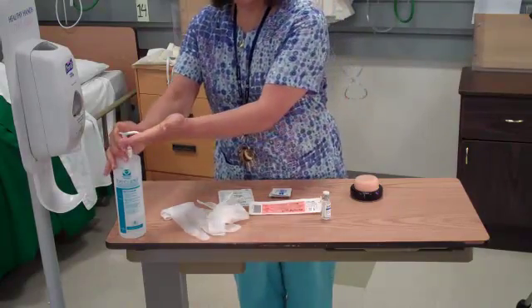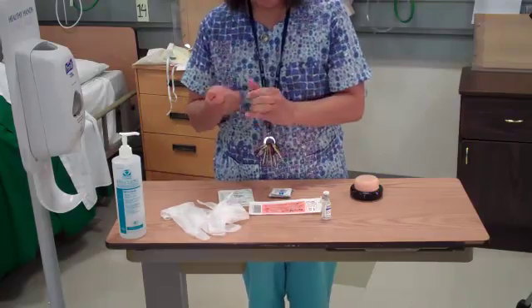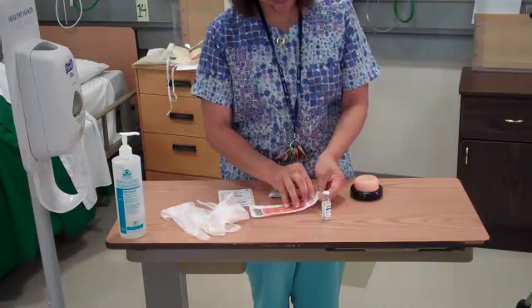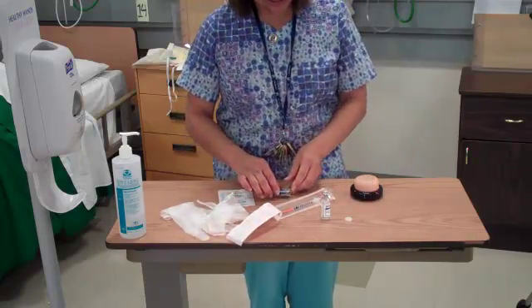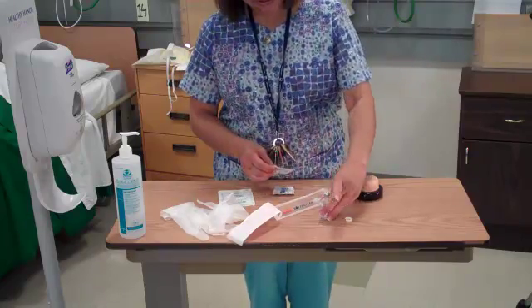I'm going to go ahead and wash my hands and get my equipment ready. I'll open up my syringe and pop the top off of my medication. In this case, I'm going to be giving 20 units of insulin. This is Lantus insulin.